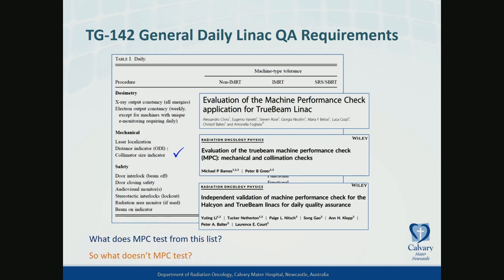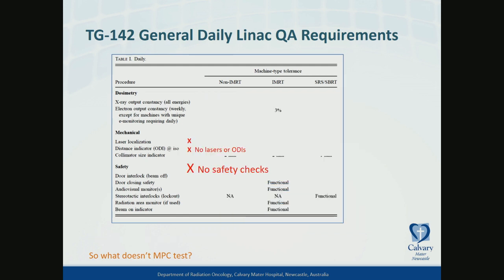So what doesn't MPC check from this list? Well, basically it's everything else. It has no lasers checks, obviously, has no optical checks, so field, ODI or field light, and has no safety checks. Although I'd probably argue that it's a bit unfair to expect these tests to be performed by a daily check device anyway, so from here on in I'm not going to concentrate on any of these sort of tests.